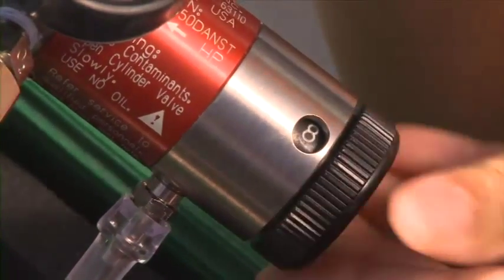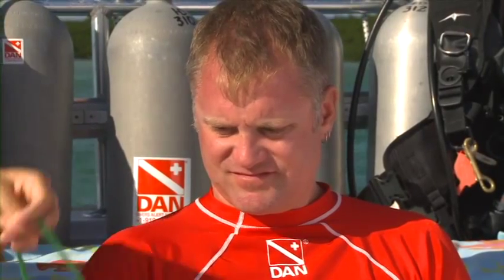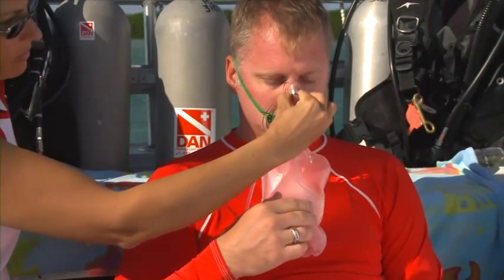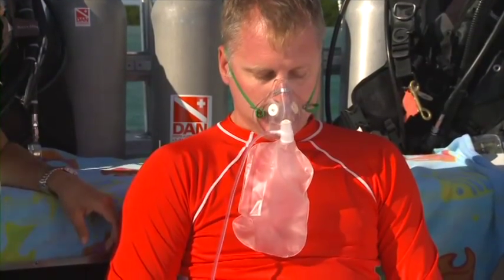Set the constant flow control to 10 to 15 liters per minute. Place the mask on the injured diver's face and adjust the elastic band around the head to hold the mask in place. Squeeze the metal clip over the nose and check to make sure there are no leaks around the sides of the mask.